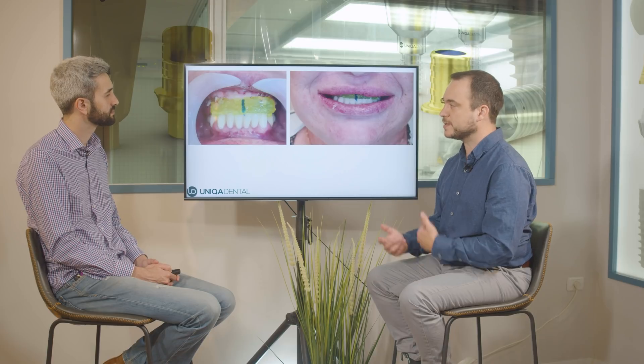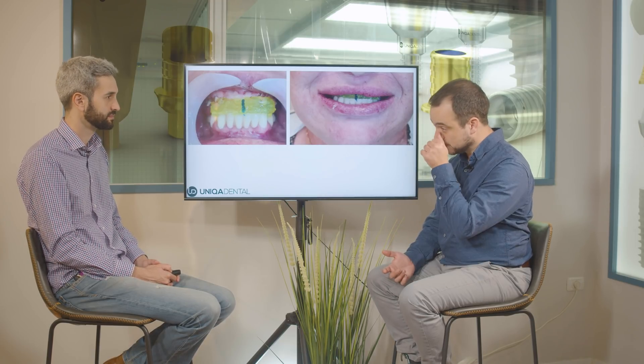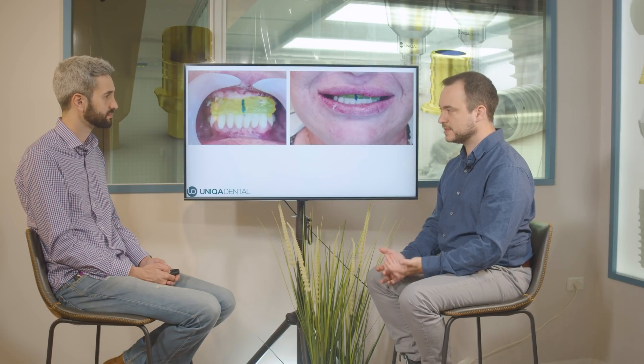So we took impressions and scanned the entire palatal area, and now we want to make some sort of composite bulk. With this composite we want to fix the VDO — the vertical dimension. On this bulk we can paint the central line and the occlusion. Using this method you get the VDO in the fastest way possible: you just add the composite, cure it, and that's it. You add one layer on top of another until you can see that with the lips and the cheeks you have enough height and everything is done in occlusion.